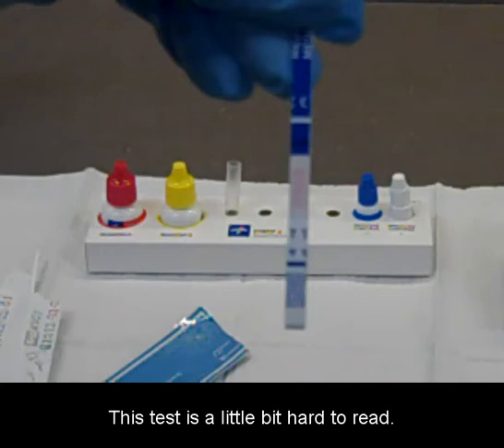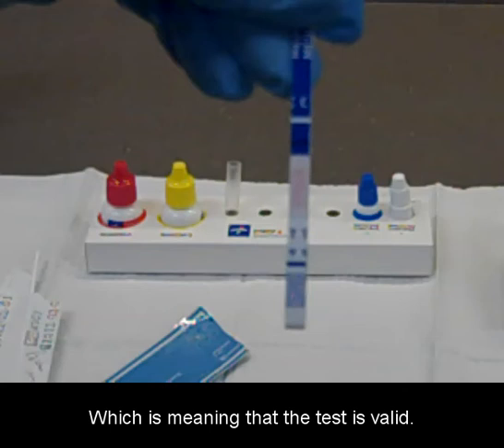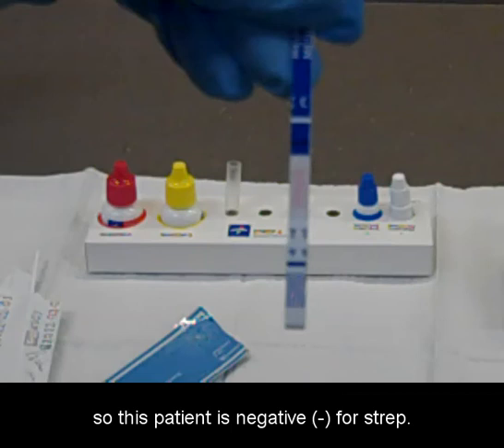This test is a little bit hard to read, but you can slightly see the control line at the top, which means the test is valid. There is not a second line underneath the control line, so this patient is negative for strep.